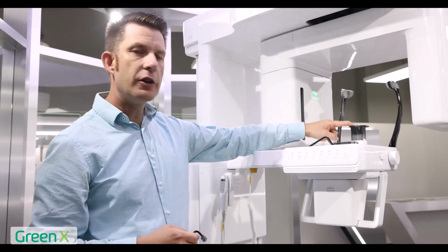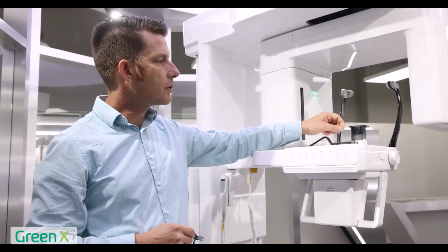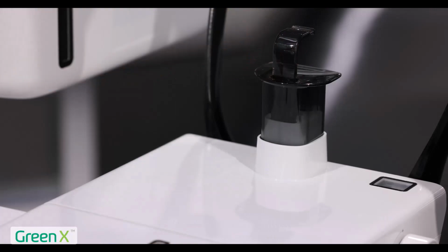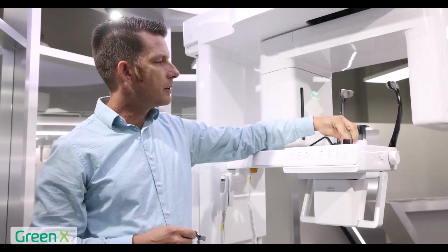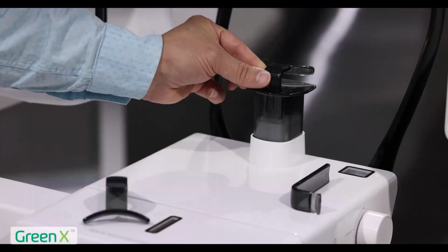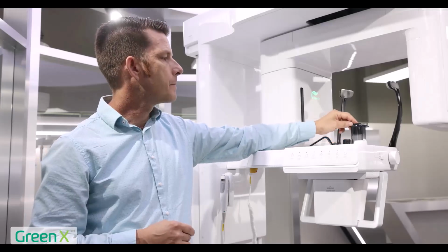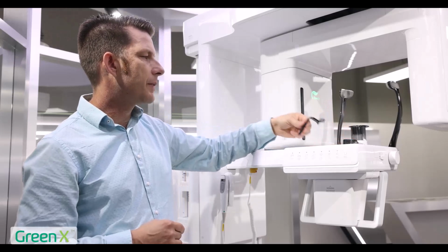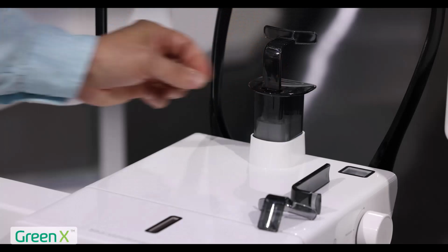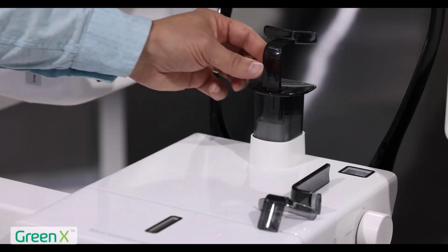These appliances interchange on the chin rest. So I'm going to go ahead and take my bite stick and it slides into the slot there. If I want to take that out, I'm going to put my dentureless cup and it's also going to slide into the chin rest there. Finally, we talked about the TMJ and sinus appliance, which is also going to slide into the device.